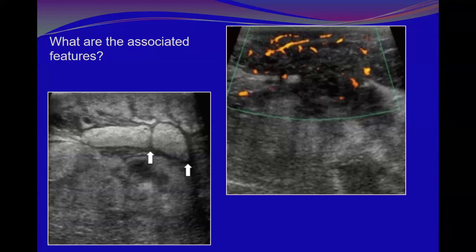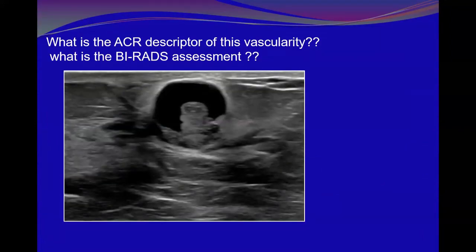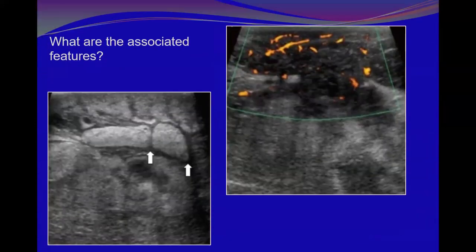Edema. Edema, excellent. Mixed vascularity, associated features: edema and skin thickening. Also skin thickening, though it is secondary to edema, it is also considered as part of the associated features.